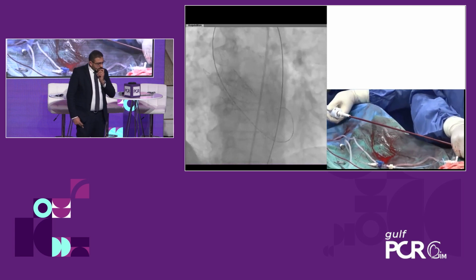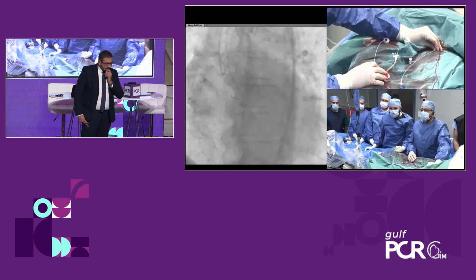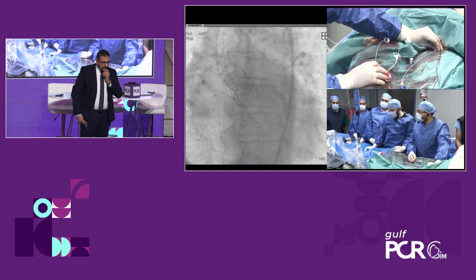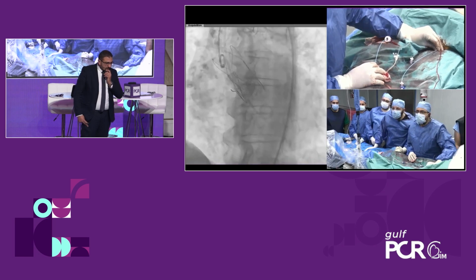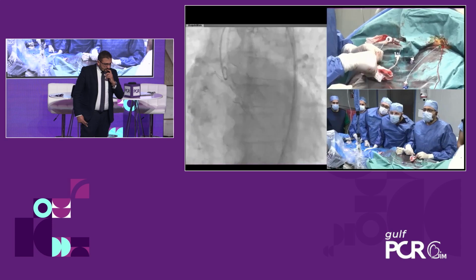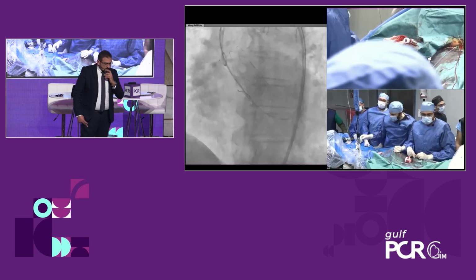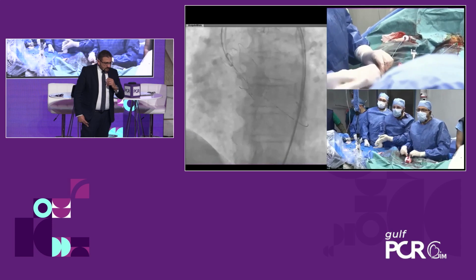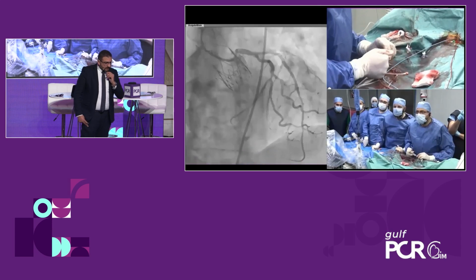So I think the valve in this image was properly expanded. We didn't see that there was any indication for post-dilatation. So patent coronaries, no paravalvular leak, a mean gradient that was single digit. Now we are taking the Safari wire out. And it's nice that you can see the posts.